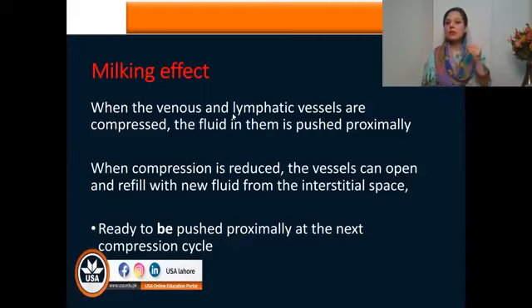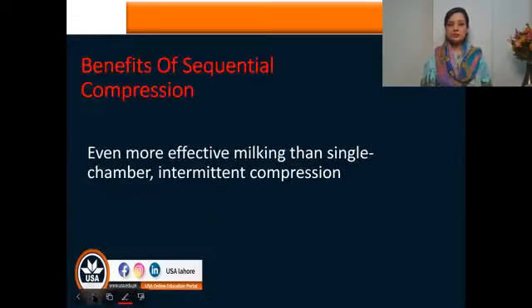When the venous and lymphatic vessels are compressed, the fluid is pushed proximally, and when the compression is reduced, the vessels refill with new fluid, so they are ready to be pushed proximally in the next compression phase. So this is the difference between static and intermittent compression.